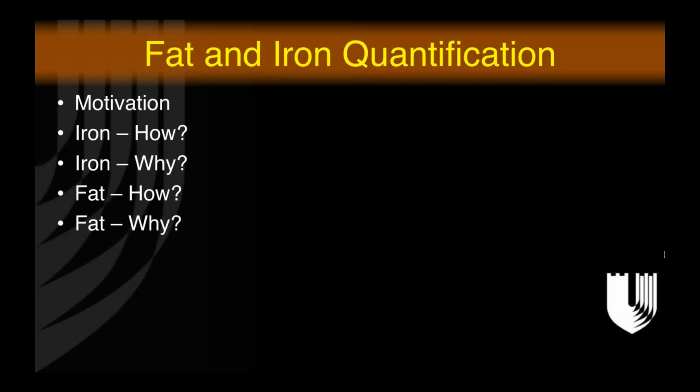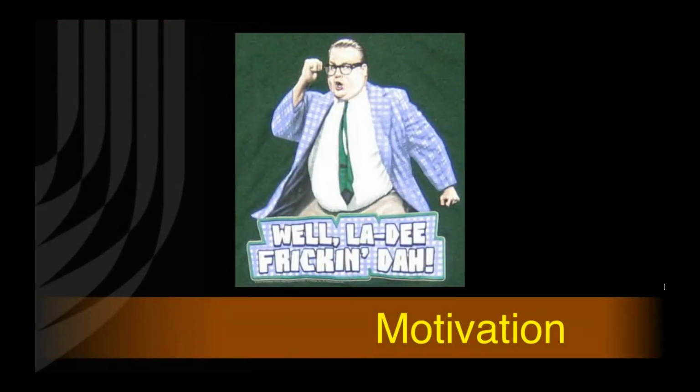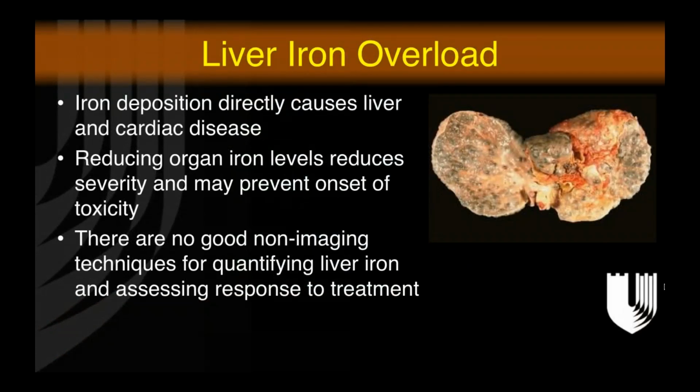Why would you do fat quantification in your practice? Because I think one of the very interesting things about these is that the original motivation for developing these methods and then how they're actually used are not necessarily the same. So let's start with why anyone was originally even interested in quantifying iron or quantifying fat.